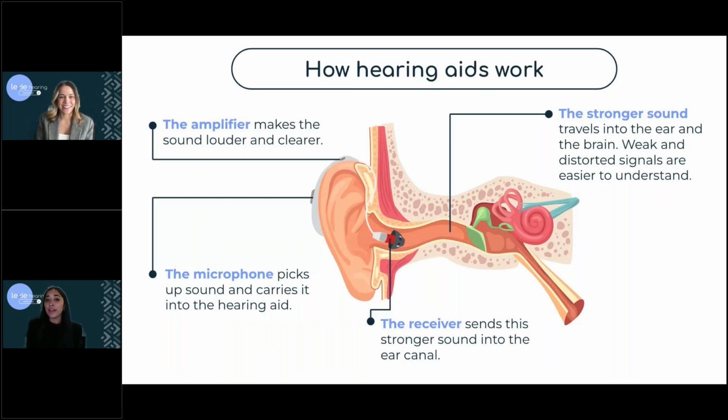Thank you. So if you've noticed any signs or trouble hearing, or especially those sounds that Dr. Paul highlighted, or you've maybe already confirmed it with the hearing test, the next step would be to start looking at hearing aids. But before we look at hearing aids, let's take a moment to look at how hearing aids work. So all hearing aids, regardless of the style, should have three essential components.